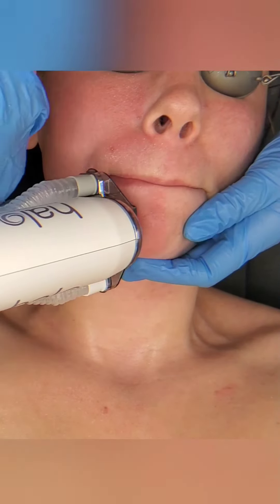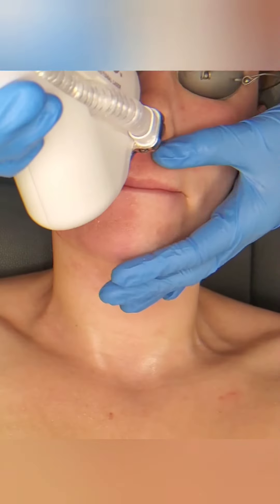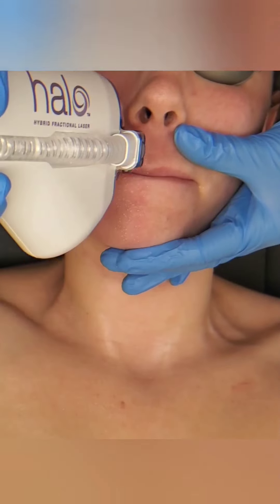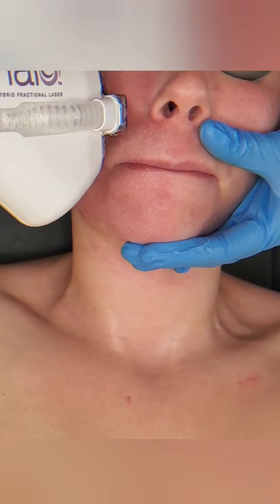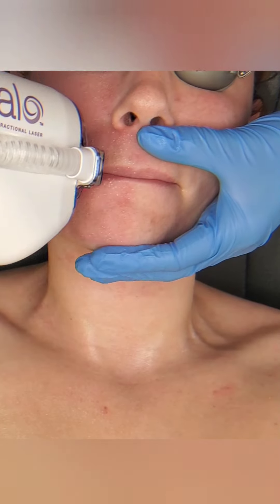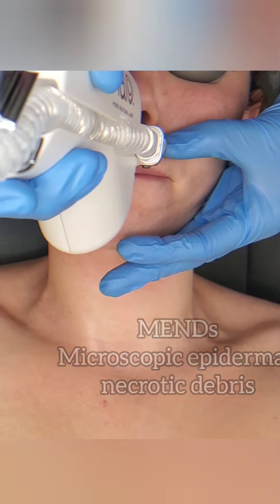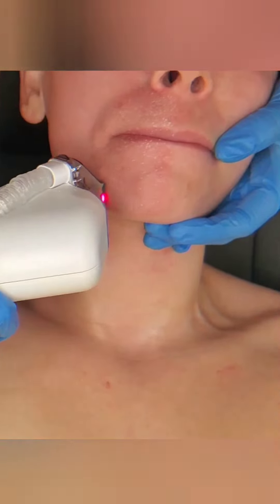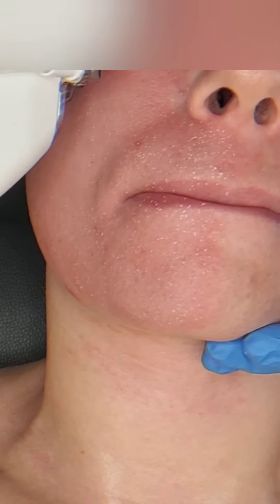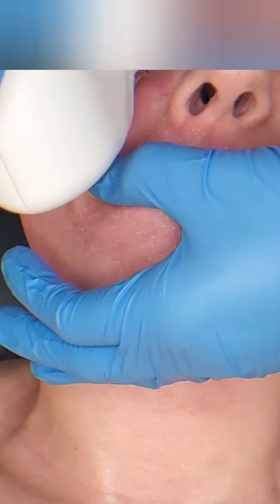Back to the downtime — those MENDs pop up typically by day four. Once that dead tissue comes off on its own, you don't want to help it. Again, just gently cleanse. Your skin is going to be insanely smooth afterward, and people just rave about how much better their texture is after the Halo.